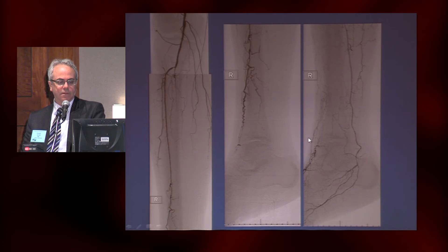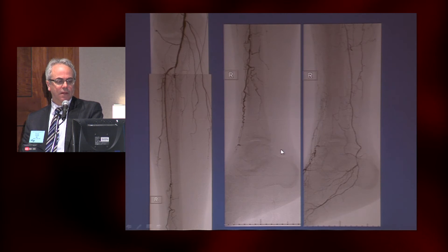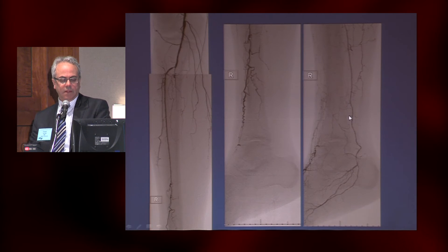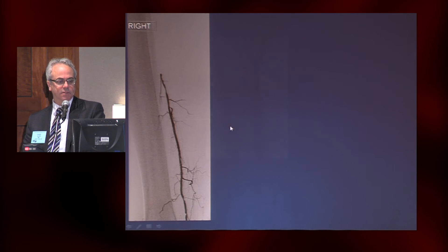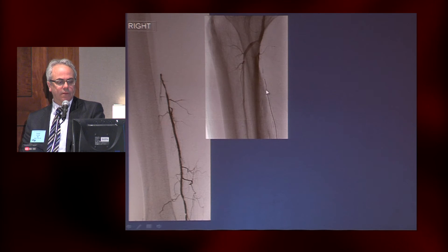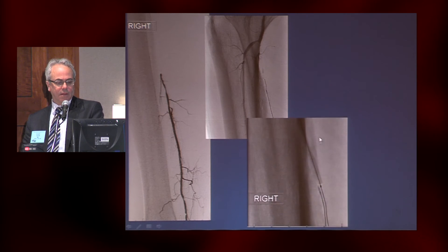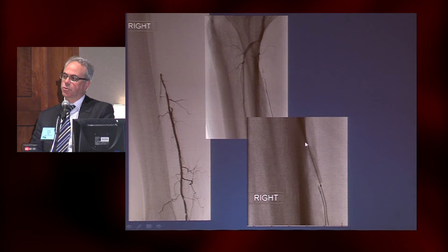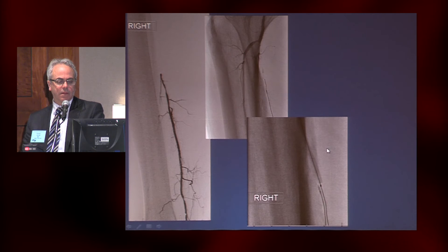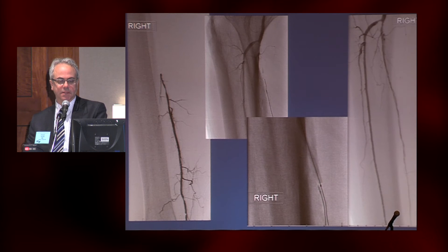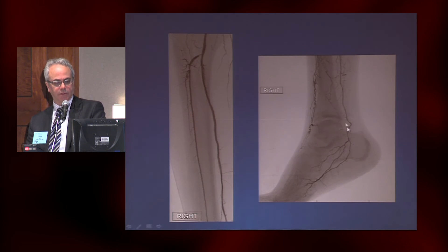Here's another case showing the challenge of getting through. There's an AT that really ends nowhere on the foot. The TP trunk is out, but distally the PT is filled by collaterals. This was accessed distally with an injection — you see the support catheter and wire having a hard time getting through even from below. Coming from above with a small balloon and wire through it, you inflate this balloon, and on deflation you pass the wire out into the space created by the balloon. Here's the completed image with balloon, a stent, and then the runoff.